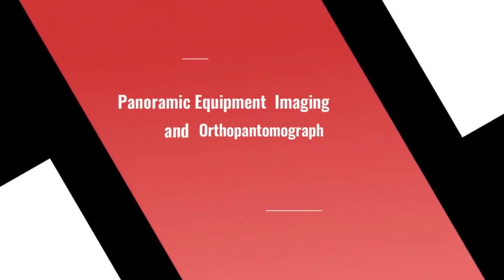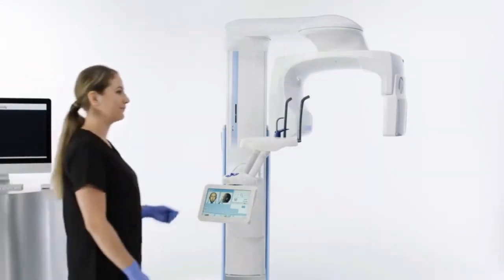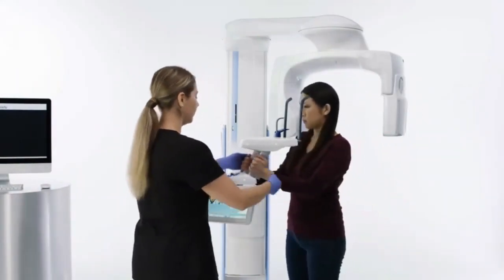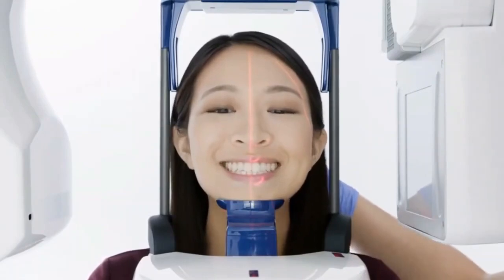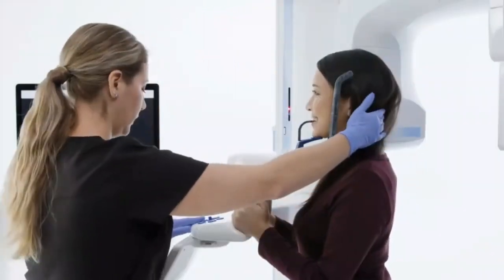So what is panoramic equipment and imaging, or orthopantomograph? Dental panoramic radiography equipment consists of a horizontal rotating arm which holds an X-ray source and a moving film mechanism, carrying a film, arranged at opposed extremities. The patient's skull sits between the X-ray generator and the film. The X-ray source is a rectangular collimated beam. Also, the height of that beam covers the mandible and the maxilla regions.